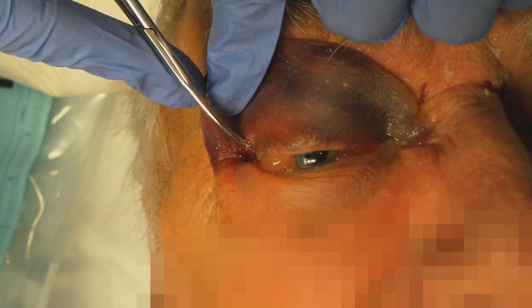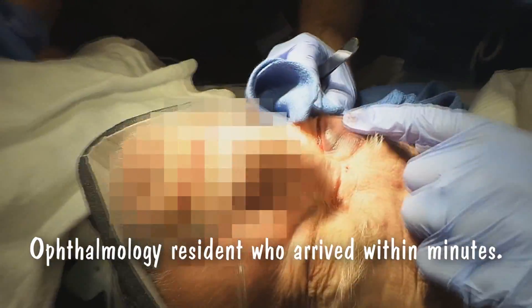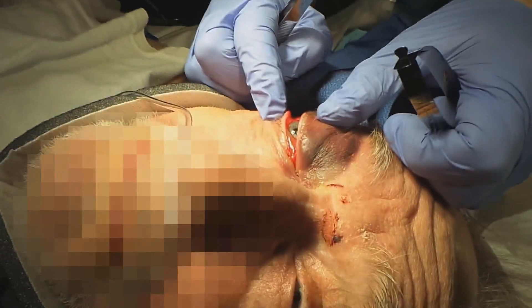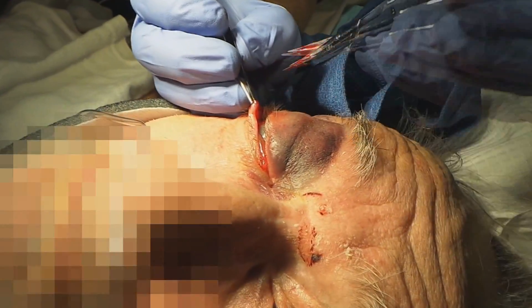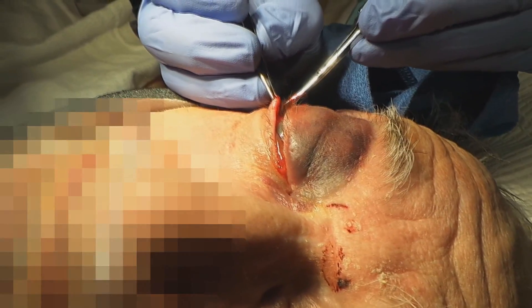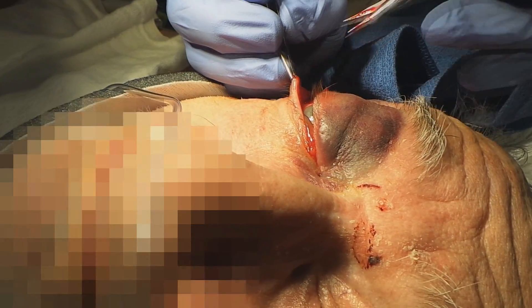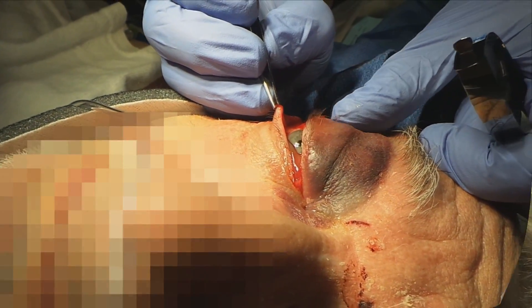Go ahead and go in and snip it. About 50 minutes ago, yeah. So what did you do differently on that? First of all, this was still not quite cut all the way, so I took scissors like that and cut through so you get the whole thing out. Then you're going to take the lower lid, grab it, keep it tense up, take your scissors and feel for where the ligament is, then start cutting while you're pulling up. When you cut the ligament you'll feel it give way. So now he has ample room to decompress. I just do below because usually 90% of the time that'll get you what you need.